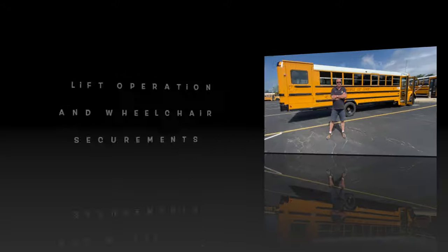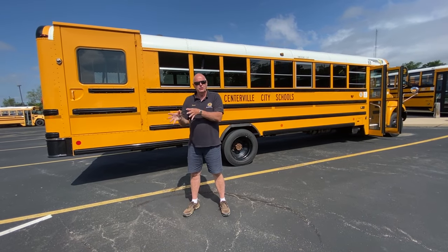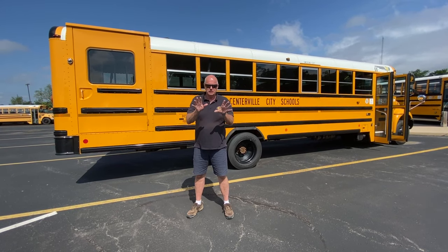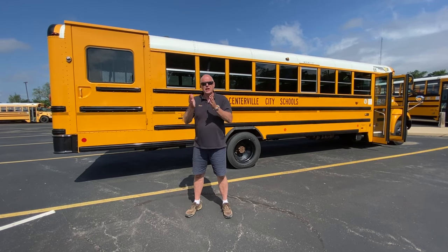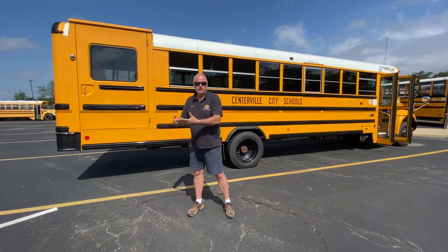Lift operation and wheelchair securements. Let's watch as Dave shows us what to do. What we're going to do today is go over the proper way to load and secure a wheelchair on our bus. Not everybody's a special needs driver, but everybody should be aware of how to do this. We're going to start at the beginning, and all new drivers and aids coming in are going through this training as well.